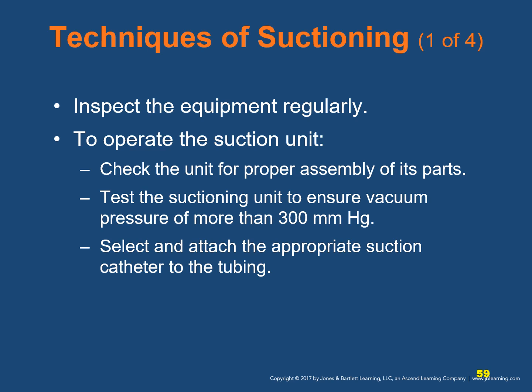French or whistle tip catheters are soft plastic, non-rigid catheters, and these are used to suction the nose and liquid secretions in the back of the mouth in situations when you cannot use a rigid catheter. This is, for example, like a patient who has a stoma, a patient with clenched teeth, or if suctioning of the nose is necessary. Before inserting a catheter, measure for the proper size. Use the same technique as measuring for an oropharyngeal airway. Do not touch the back of the airway with a suction catheter. This can activate the gag reflex, causing vomiting and increasing the possibility of aspiration.